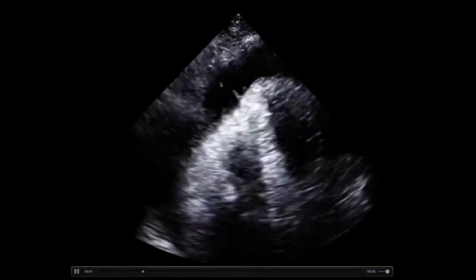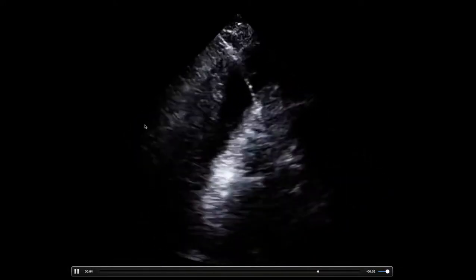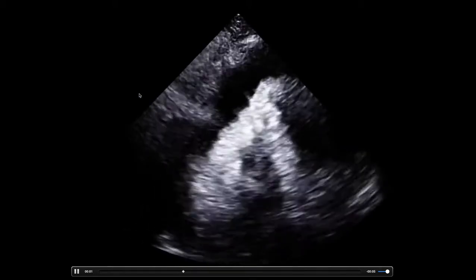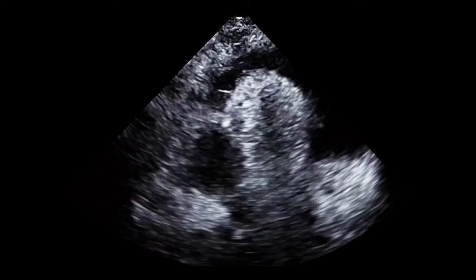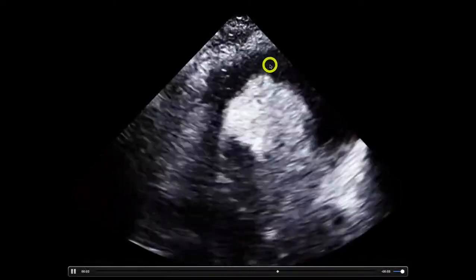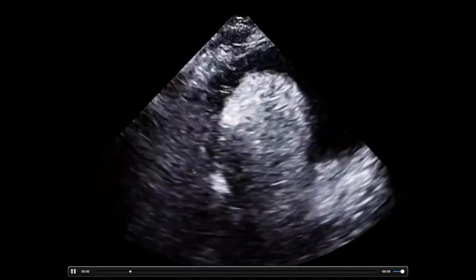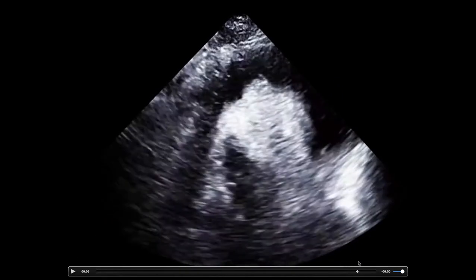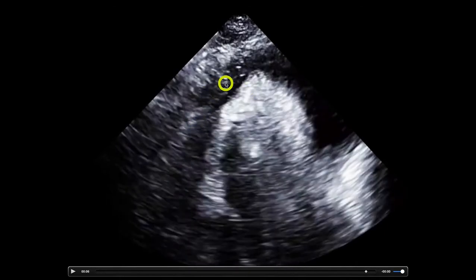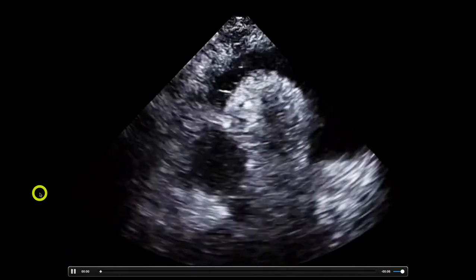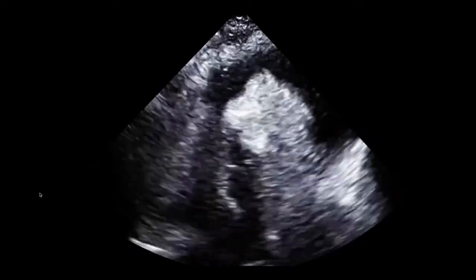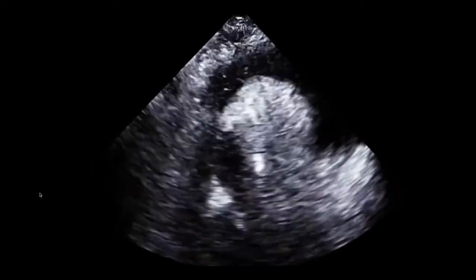You can see the guide wire right there being advanced — watch it loop around and you can see the J-tip. After getting the needle in and pulling out a little fluid, you can flush with saline. Don't flush first in a hypotensive patient because even 10cc of additional fluid might push them over the brink. Pull a little fluid out first, then flush. See all that white material swirling around? Those are the flush particles visible only in the pericardium and not inside the heart — confirming you are in the right place.